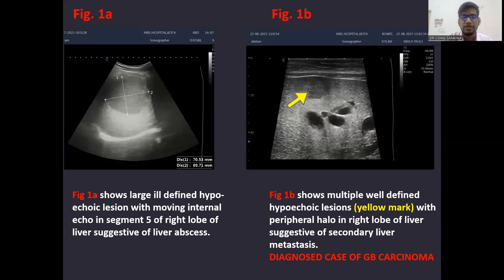The first image shows a large ill-defined hypo-echoic lesion with moving internal echoes in segment 5 of the right lobe of liver, suggestive of liver abscess. The second image shows multiple well-defined hypo-echoic lesions with peripheral halo in the right lobe of liver, suggestive of secondary liver metastasis — a diagnosed case of GB carcinoma presenting with secondary liver mets.